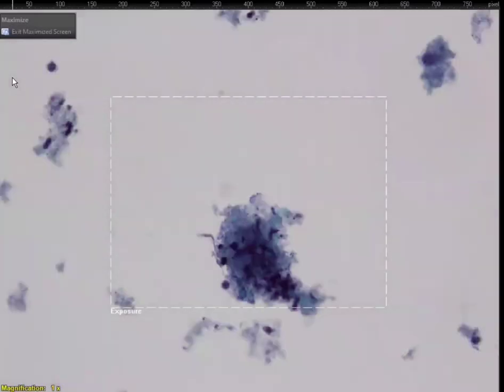So actually, you know what we call this thing, and I'm trying to find something that's going to help us here. And there's no marks on this thing. They call this a granuloma. Yeah. What they did. They did. And I'm wondering if we had a cell block. Let me see. Do we have 18?